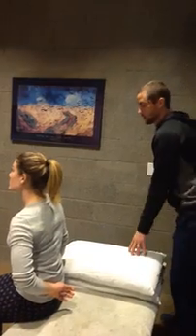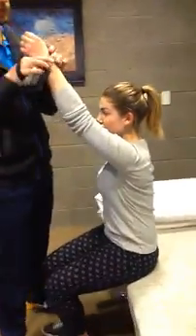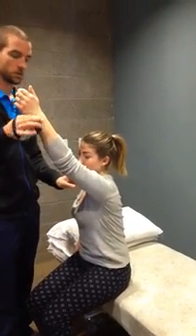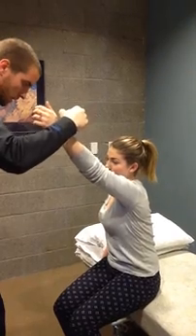Good. The last one we do in sitting is our serratus anterior. So I'll have you kind of come back around to the side here. Here we're at roughly 120 degree angle of shoulder flexion. I do want her to protract a little bit, and she's going to hold that position, and she's going to not let me move her. Hold, hold, hold. Good, and then you go until it breaks.